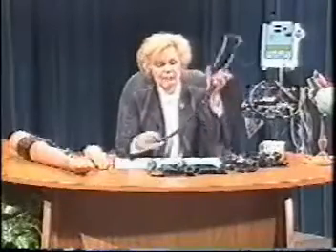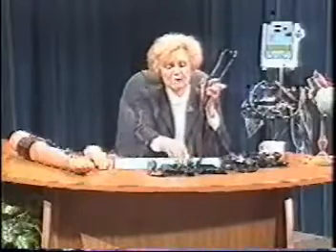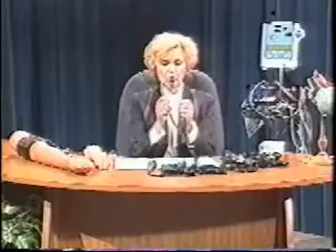The next portion of the stethoscope is the tubing. There are two tubes, and the sound is carried from the diaphragm and the bell up through the tubes and into the earpieces at the top. The earpieces are responsible for directing the sound into the listener's ears. To hear the sound most clearly, the earpieces should be directed forward, as it is. I don't know if you can see that very well, but directed forward and down into the ear. So check the earpieces before you put them in.